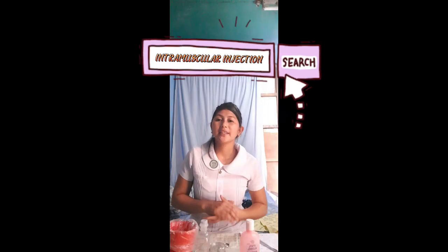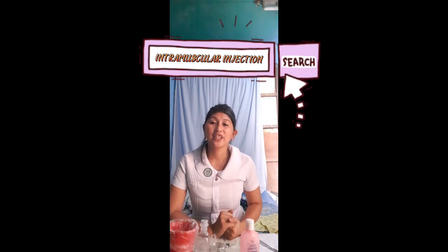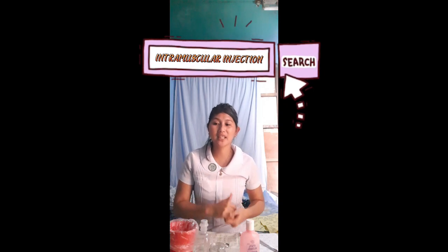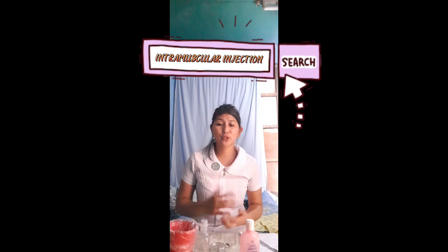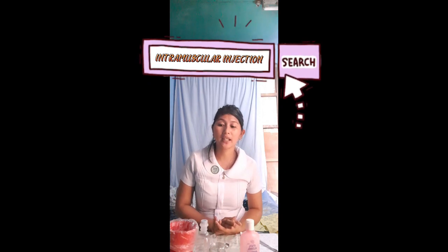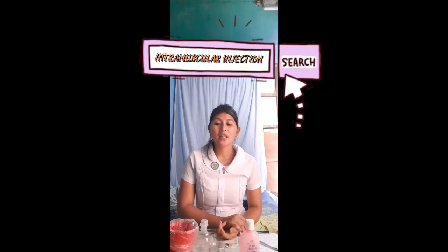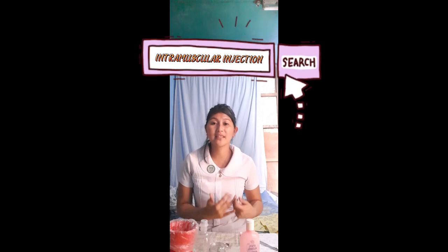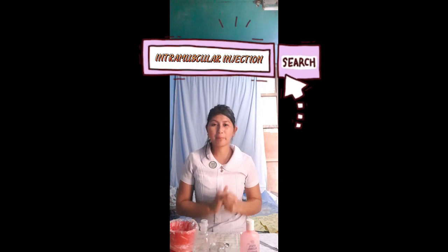The next parenteral drug administration is intramuscular injection. It is the introduction of medication deep into the muscle tissue, where a large network of blood vessels can absorb it readily and quickly. For the preparation of the intramuscular injection, the doctor has ordered 5 milligrams of morphine sulfate to address pain.